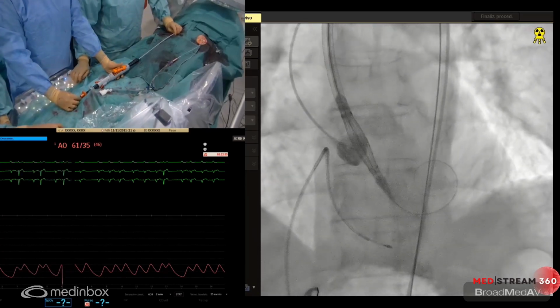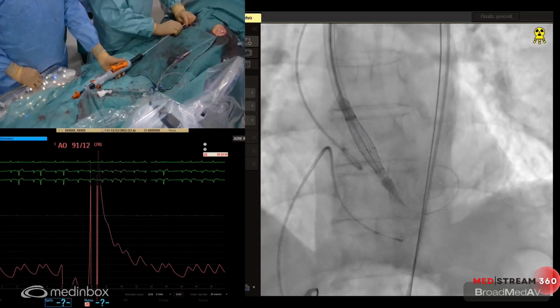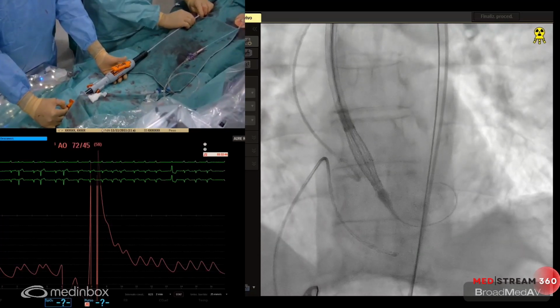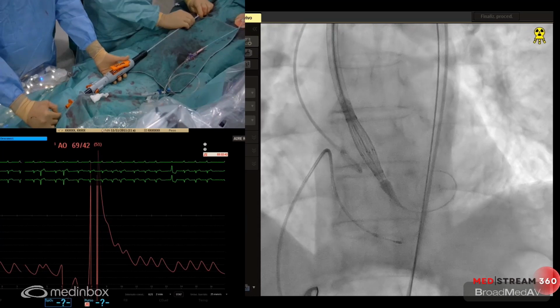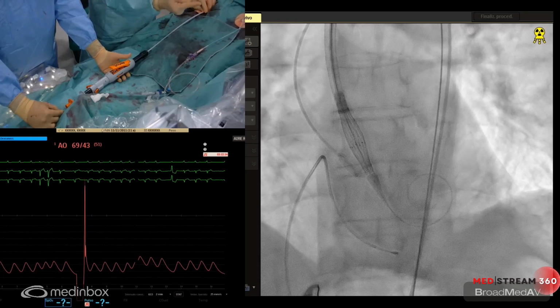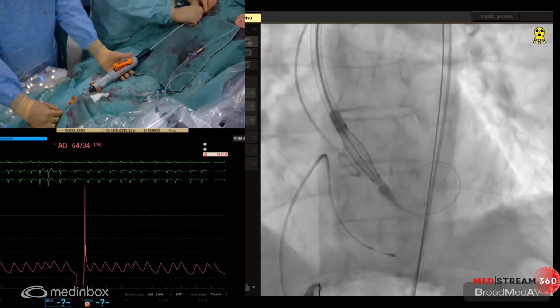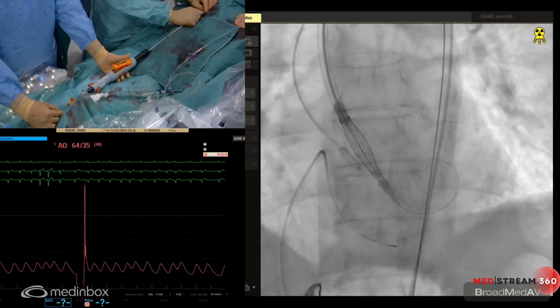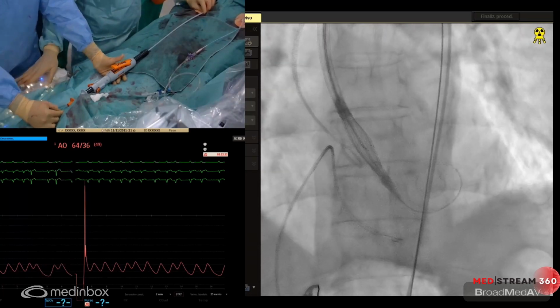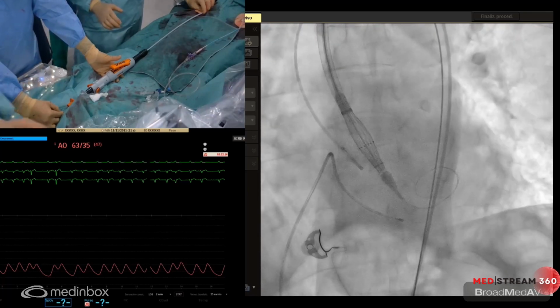These radiopaque markers are gold markers. As you can see, there is a radiopaque line that should be more or less at the level of the aortic annulus. We are retrieving the valve. We are too high. If we are too high now, the last movement should be from the left ventricle to the aorta. So we have to go deeper and then go out again. There is no good alignment of all the gold markers, so we try to go more caudal to align it.